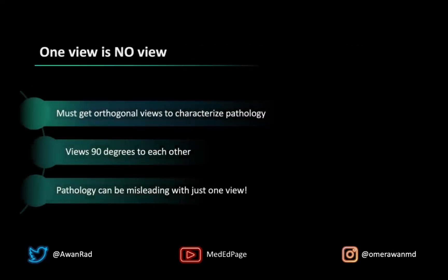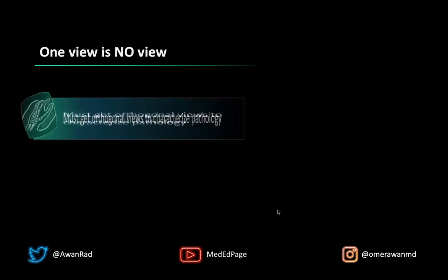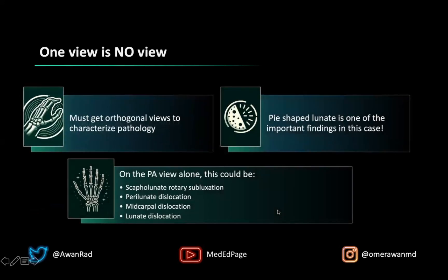The teaching point for this case really is that one view is no view. In radiology, in order to really characterize pathology well, you must get two views that are 90 degrees to each other to assess exactly what is going on. This is a nice example of how just looking at the PA radiograph is not sufficient — you really need two views to understand what's going on and decipher those four diagnoses. The finding on the PA radiograph was a pie-shaped lunate, indicative of instability or carpal malalignment, but it doesn't tell us exactly what the diagnosis is.